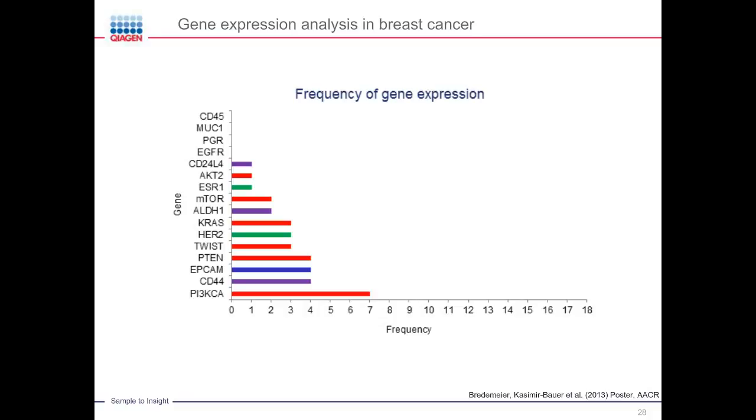And the first panel that we developed, which is, by the way, not commercially available, this was really the first try, but already successful, was a panel consisting of epithelial-like genes, genes that are important in EMT metabolism, and genes of the tumor stemness family like CD44 or ALDH1.